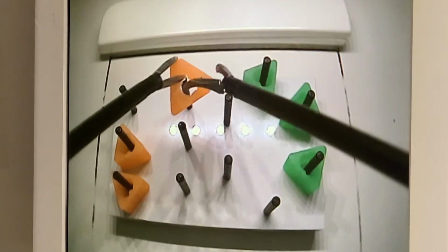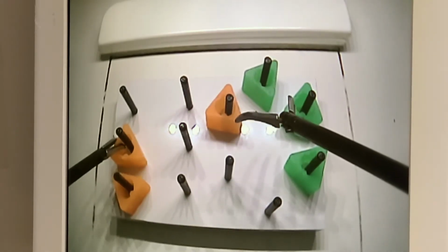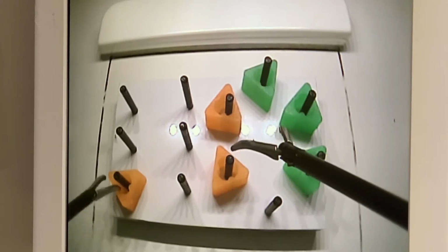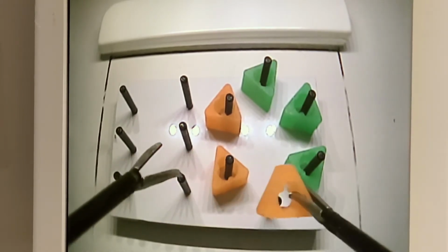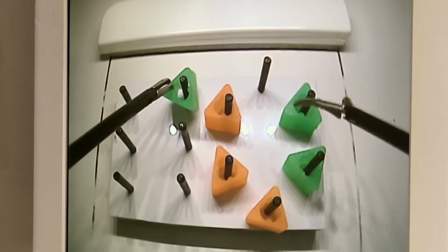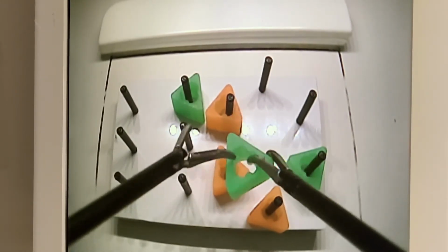Pick up a block using the Maryland dissector in your non-dominant hand. Transfer the block midair to your dominant hand and set it down on the opposite side. Repeat for all 6 blocks. Then move all 6 blocks back to the starting position using the same method.